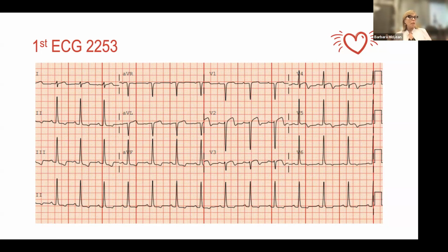Does that mean that it's possible this is a non-STEMI? And of course, that'll be the next thing I think. I'm going to rule out PE. I'm going to rule out non-STEMI. I'm going to look over here at his chest leads. He does have some ST segment elevation here in V2, a little bit in V1, but often you'll see ST segment elevation in V1, V2, and sometimes into V3 when you have LVH. So that's going to make this really muddy for me.